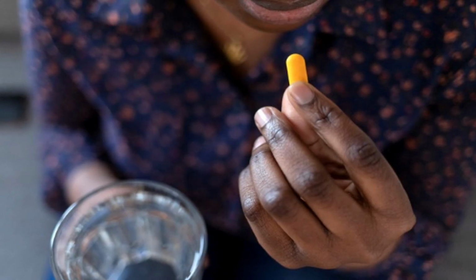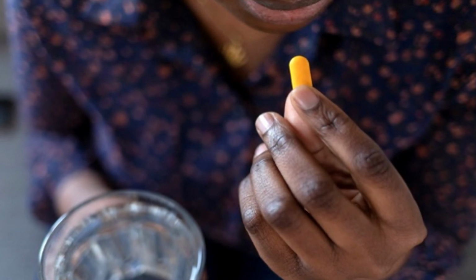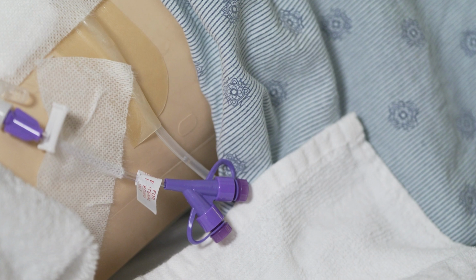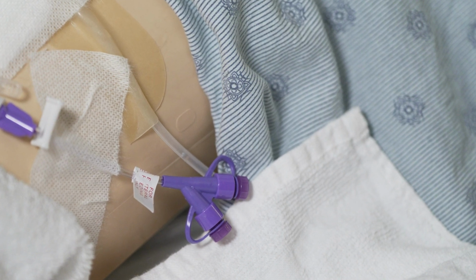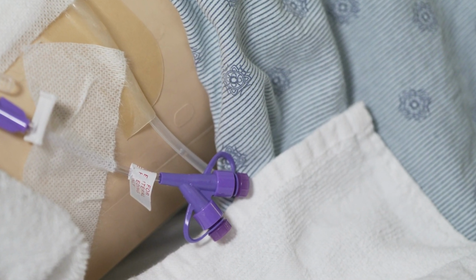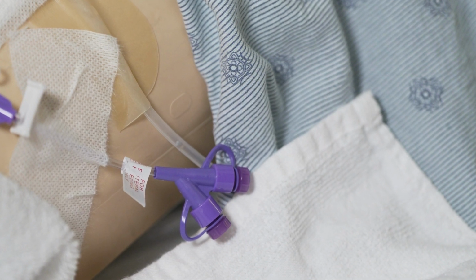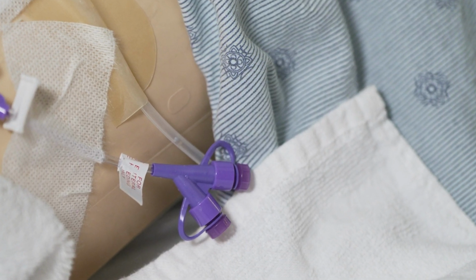If you are able, and it is okay with your doctor, take your medicines by mouth. Any medicine given through the J-tube must be liquid. Do not give crushed medicines through the tube. This will clog the tube and cause problems. Give each medicine one at a time. Do not mix medicines together.